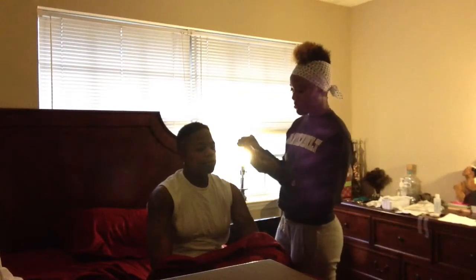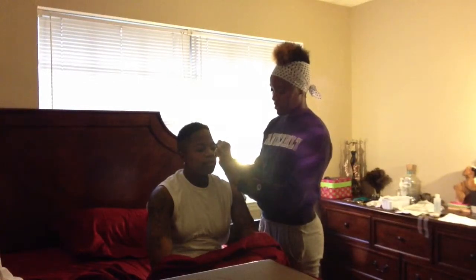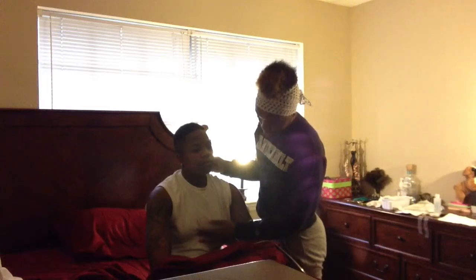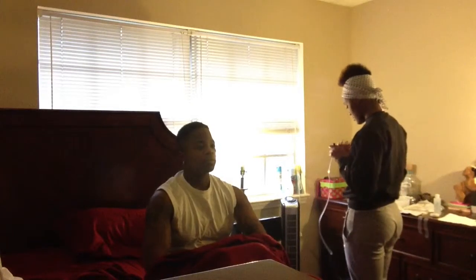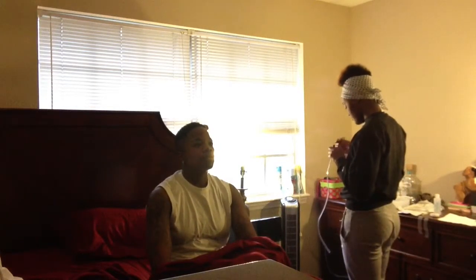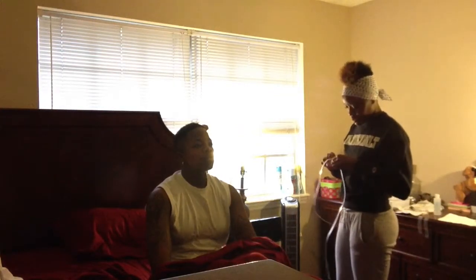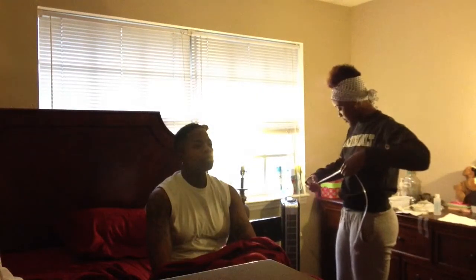I want to measure the tube, so we're going to go from the tip of the nose to the earlobe, and down to the xiphoid process. So once I have that measured, I'm going to mark the tube. And I'm also going to measure the length of the tube because I'll have to document it later.